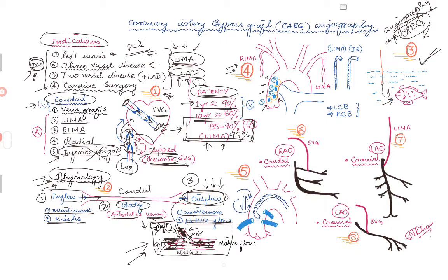But not all the time will you find very good or helpful surgeons who put these rings. So what you have to know is that the vein graft to the right coronary artery will be on the right side, and on the left side you will have the grafts going to the circ or the diagonal. What surgeons usually like to do is place the lowermost graft going to the diagonals or the LAD if they're not using LIMA, and then as you go to the circ or other arteries, they go sequentially up.